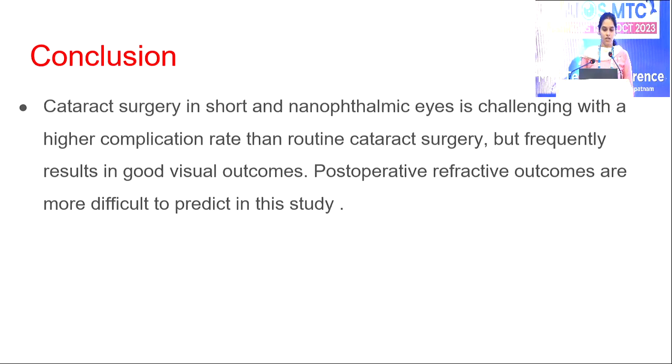Conclusion: cataract surgery in short and nanophthalmic eyes is challenging with a higher complication rate than routine cataract surgery, but frequently results in good visual outcomes.